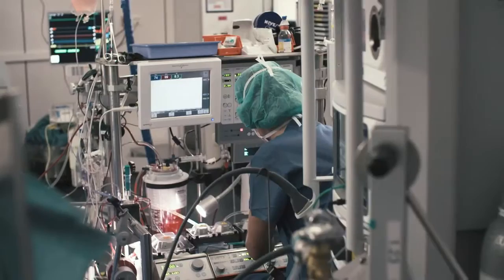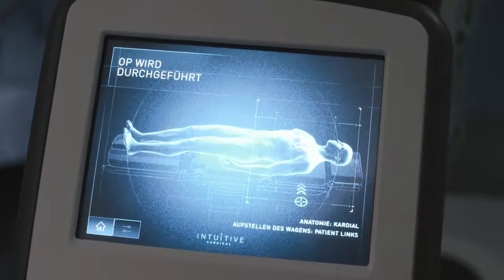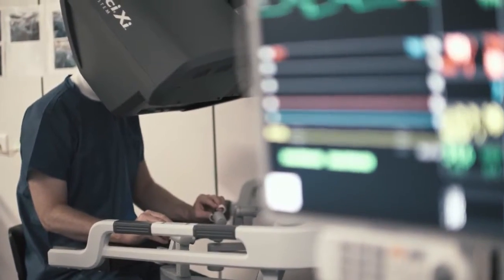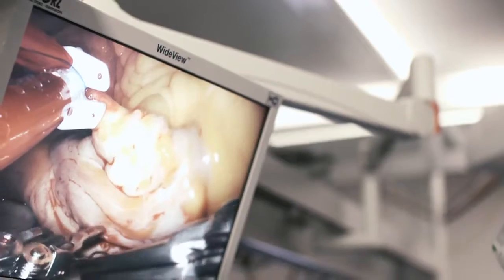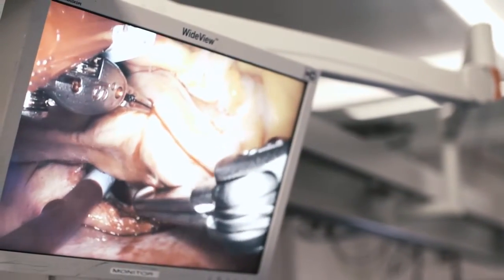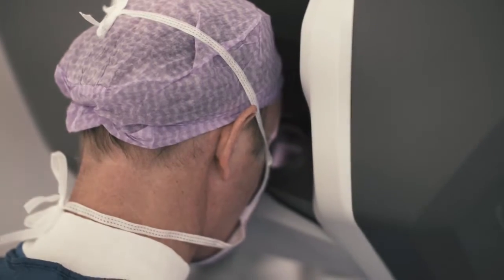The principles of DaVinci surgery are that there is one surgeon sitting at the console, and the robot transmits the movements of the surgeon's fingers into the chest. There is a table-sided surgeon who assists the console surgeon and the robot in different maneuvers such as tying knots, inserting rings, and changing instruments.